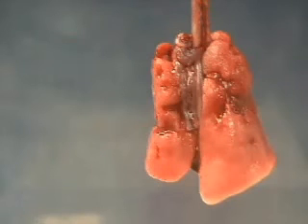We can see that it takes many ventilatory cycles for the lung to be recruited. In patients, the time is much longer than the few breaths shown here, and it can take hours, depending on the disease process and the pressures applied.